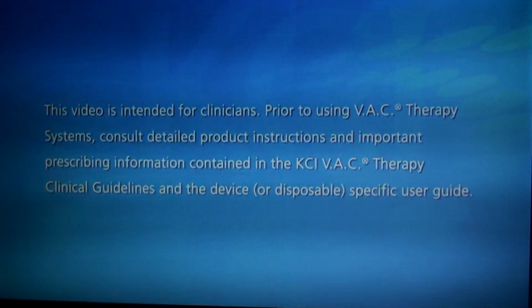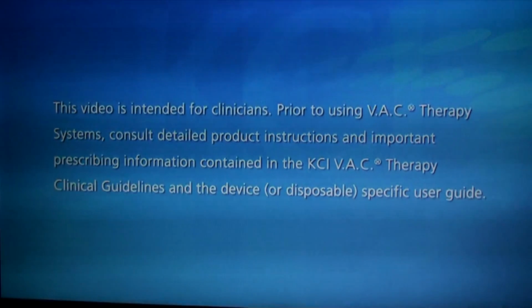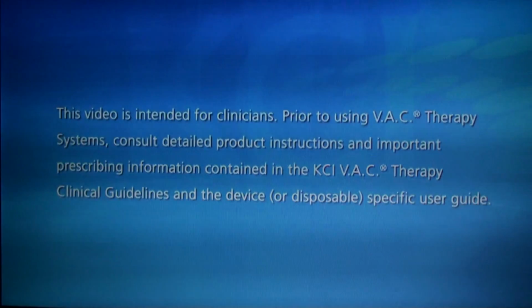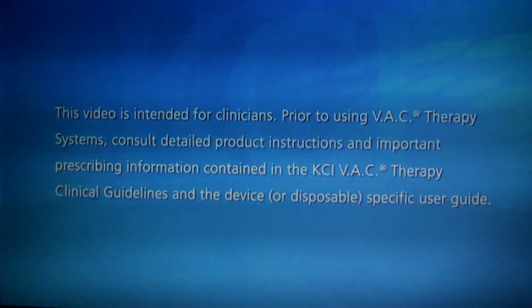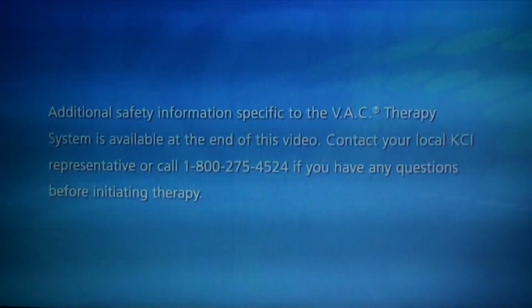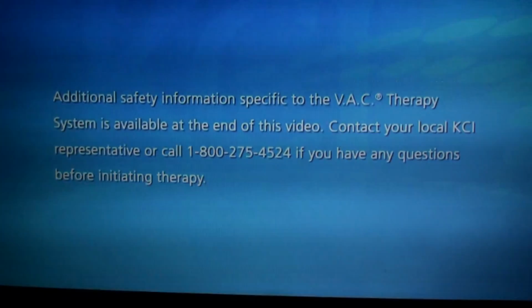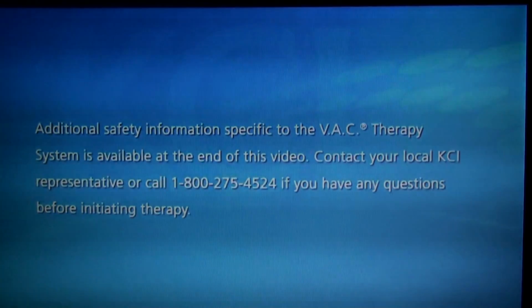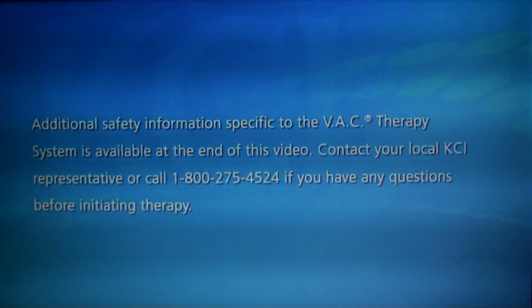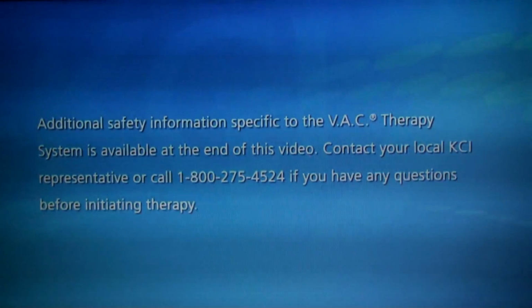Prior to using VAC therapy systems, consult detailed product instructions and important prescribing information contained in the KCI VAC therapy clinical guidelines and the device or disposable specific user guide. Additional safety information specific to the VAC therapy system is available at the end of this video. Contact your local KCI representative or call 1-800-275-4524 if you have any questions before initiating therapy.